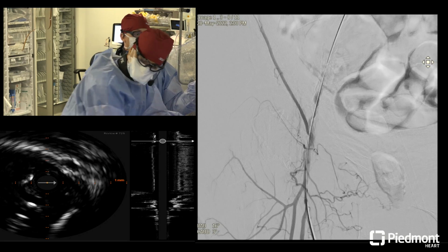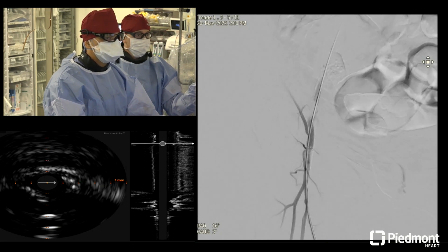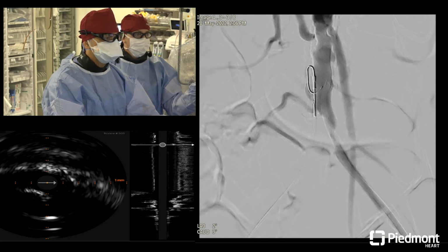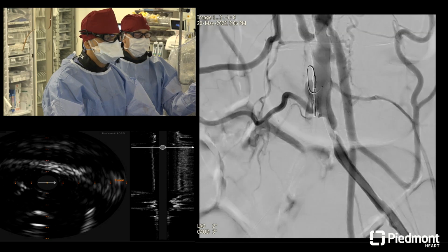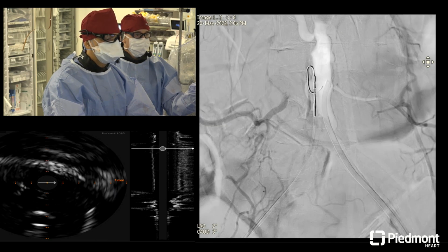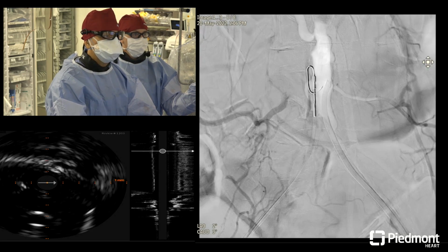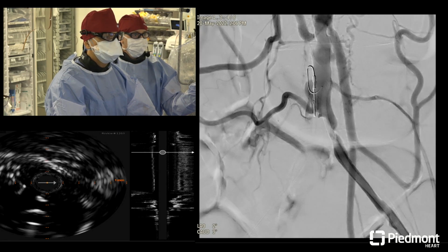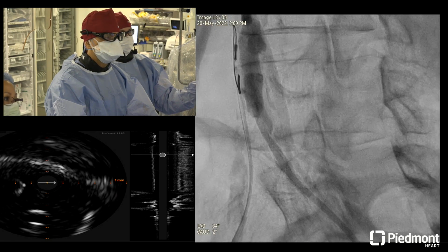So basically, that's where we were. You can see we're in the SFA when I back that out, the change out for the sheath. We were clearly subintimal. At this point, we've moved up to IVUS-guided re-entry to try to punch back in with the Pioneer, and you can see how diffuse the distal abdominal aorta is disease-wise. Getting this aligned was not very easy.